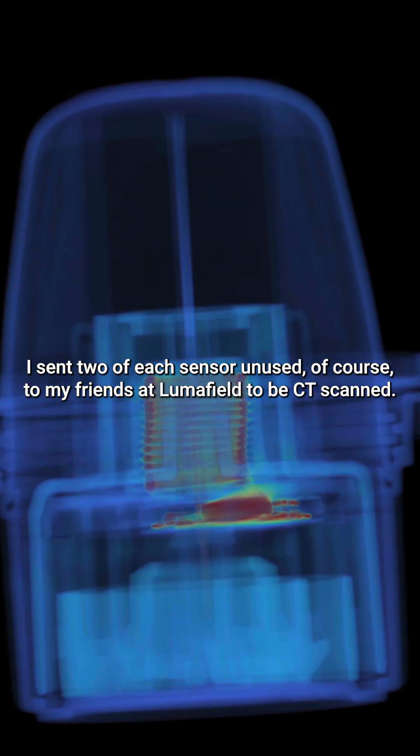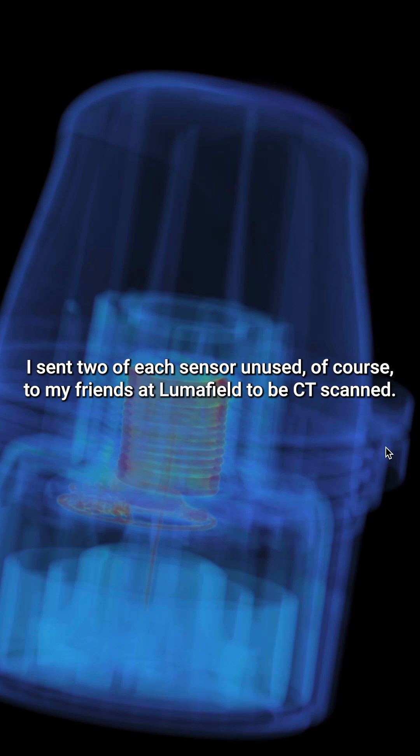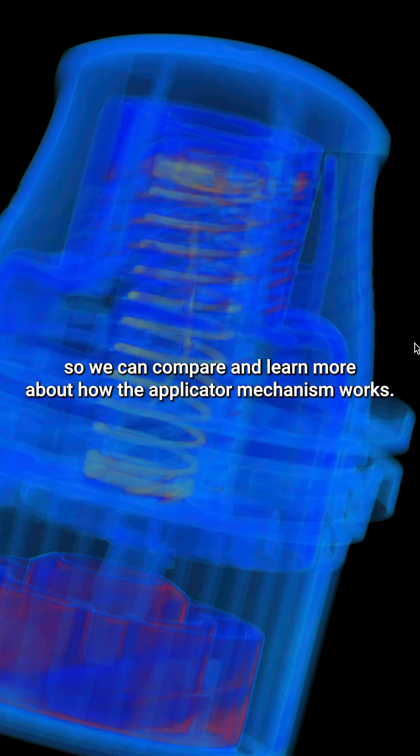I sent two of each sensor, unused of course, to my friends at Lumafield to be CT-scanned. One is deployed and the other isn't, so we can compare and learn more about how the applicator mechanism works.